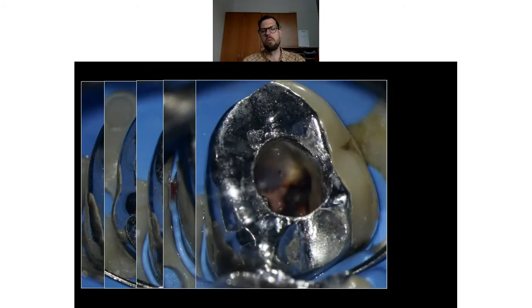You will find the MB1, MB2, the distobuccal. You see that I still have the post in the palatal canal because the case was so difficult that I had to do it not in one, but in two or three sessions. I don't remember anymore, but more than two.